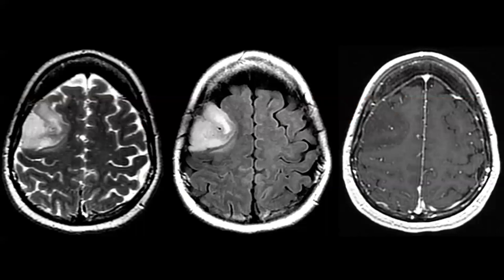The model. Let's have a look. Here's the imaging. What you see on the far left is a T2, and then the T2 FLAIR. There is no T2-FLAIR mismatch, and you can see, especially on the T2, heterogeneous texture. Heterogeneous texture refers to the varying intensities on T2 and T2 FLAIR. That's very characteristic of oligo. It's a little bit fuzzy, maybe on the bottom part. Could be fuzzier. I would like for it to be a little fuzzier. That is a characteristic of oligo versus IDH mutant diffuse astrocytoma. And the far right panel is just an axial T1 with contrast showing that it is a non-enhancing tumor.